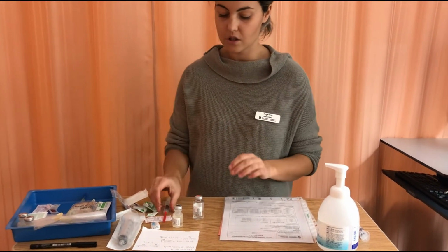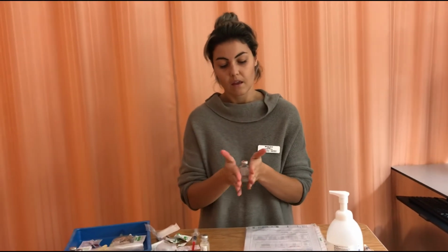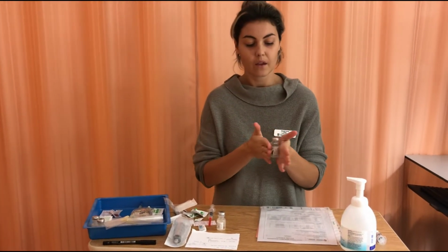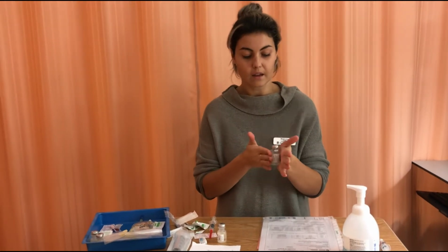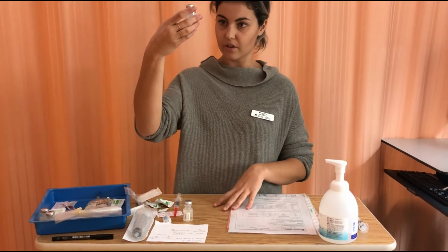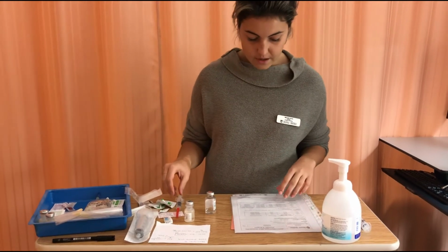Recap my syringe to maintain sterility, and then just rotate the vial slowly, and mixing it this way ensures that we don't create additional bubbles in the vial that we don't want when we're pulling it up. And I'm just making sure that everything is diluted. It is. All right.